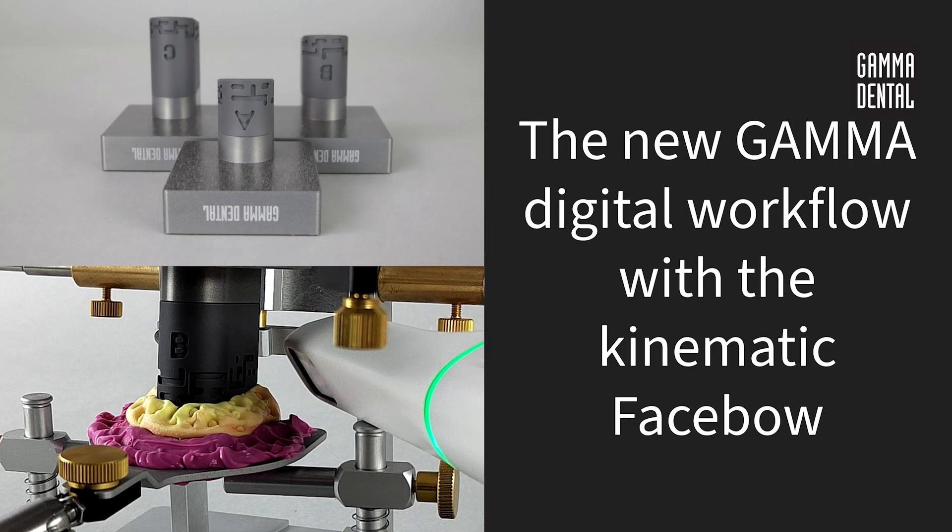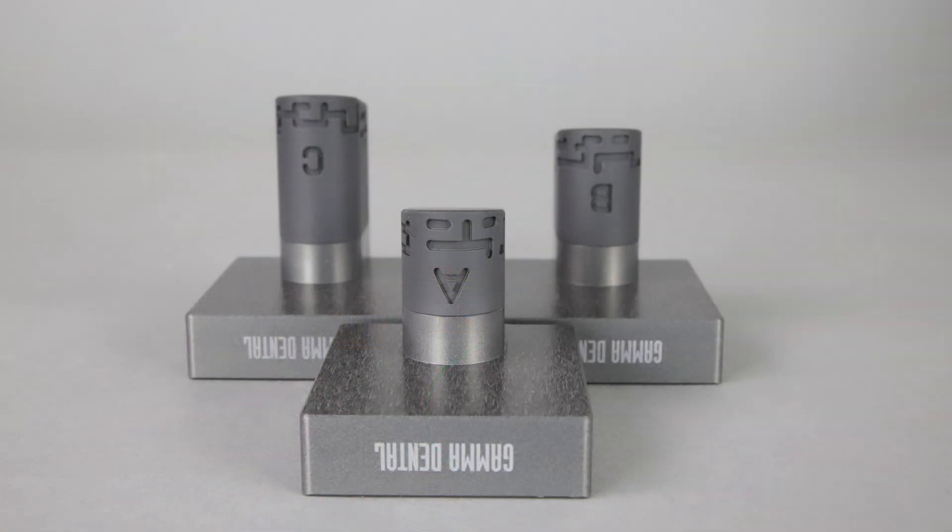Hello and welcome to this Gamma Tutorial. Today we will introduce our brand new Gamma Digital Workflow. Therefore the Gamma Digital Transfer Blocks are required.